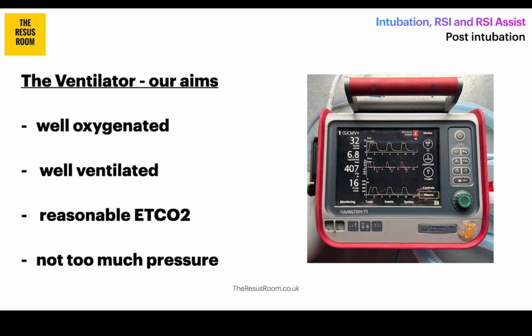And this is different from the end-tidal CO2 reading you will have, as end-tidal CO2 also reflects any alveolar dead space. So now in terms of correlation, a general rule of thumb is that end-tidal CO2 is normally about 0.7 to 1 kilopascals lower than your partial pressure of carbon dioxide. So that's where you want to be targeting it.